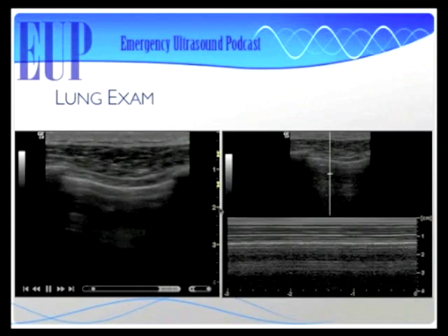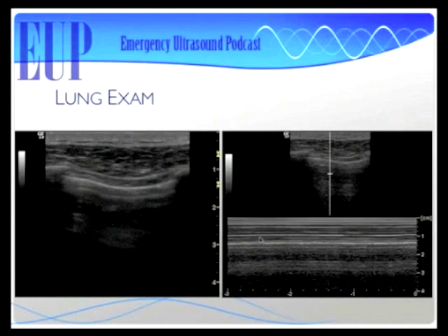Beach. Got it. And that's the whole principle there, is that M mode looks like waves crashing on a sandy beach. Like there's sand down there. I don't really like that one very much, but we use it anyway. People like to talk about it.